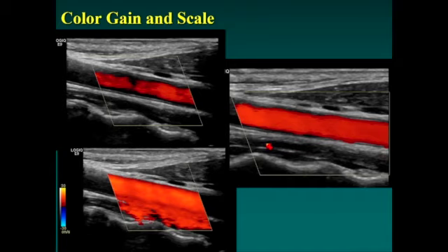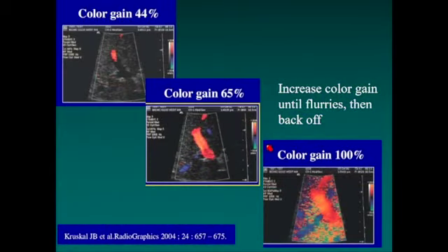So there are real consequences to all that. Here again, gain settings at 3 different settings, and you can see how radically that can change. So if you have a new sonographer and they're not getting flow, say in the portal vein, one of the things to be alert to is have they optimally gained, is the gain setting appropriate?